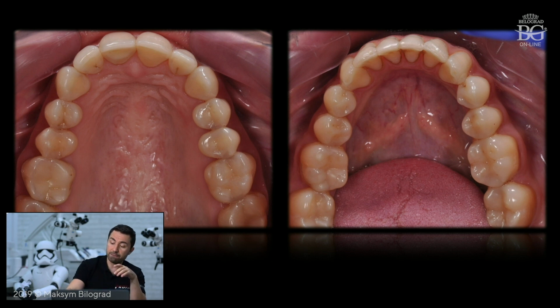So basically, we have three options in order to make teeth longer and to be safe. First, we can increase VDO, to get some room. Another option, orthodontic treatment to make teeth protrusive. And another option is more aggressive preparation of the lower third or incisal third of upper teeth, and artificially we can move them forward with porcelain veneers, and also we have to make some adjustments of lower teeth just to make them slightly inclined, so that there will be a smoother pathway and envelope of function.